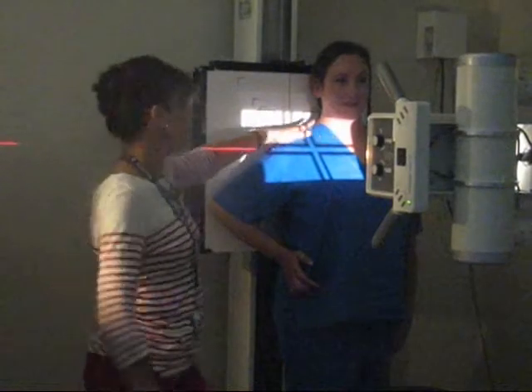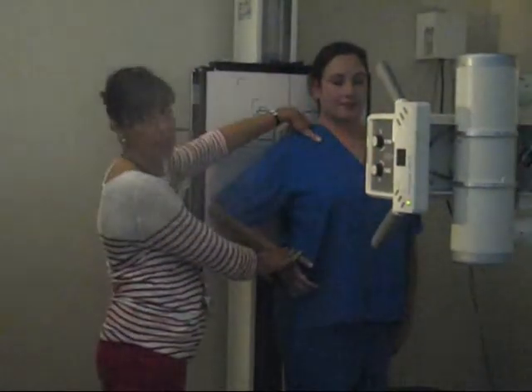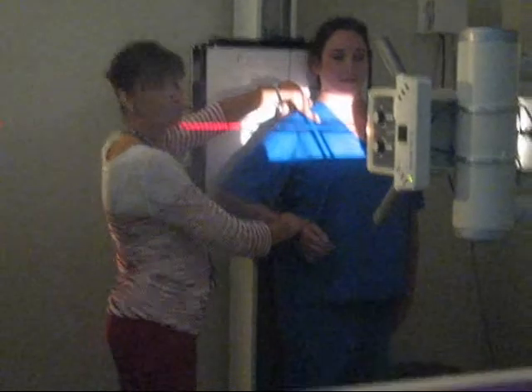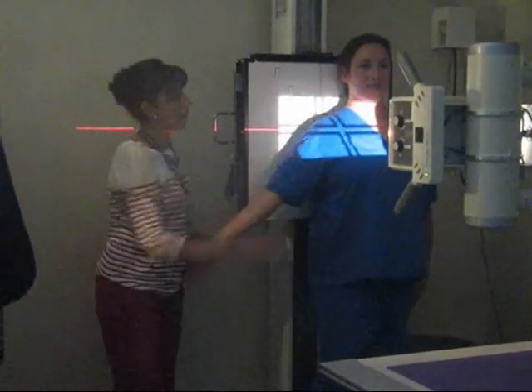Okay, go ahead. All right, so for your external rotation, your patient's going to be in the exact same position. Everything is going to be the exact same thing, except that the arm position of the patient is going to abduct and do external rotation, which means bring the palm forward, okay? Same exact everything, all right?